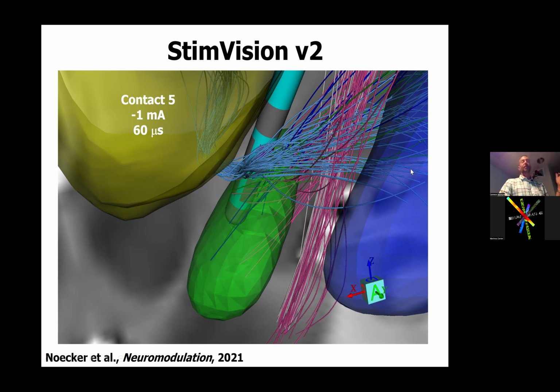In this particular simulation, even though this is just an N of 1 experiment, I picked it because it shows things that I want to tell you. With good, robust therapeutic benefit from subthalamic deep brain stimulation, there are very few of these little green lines. These green lines are the subthalamic nucleus neuron lines that go from the STN to the globus pallidus.